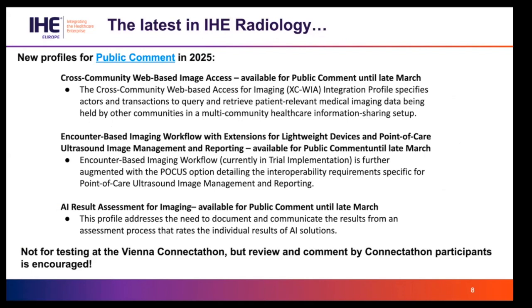And it's based on the initially developed XCAI profile, which has been in trial implementation for quite a while, but eventually was incorporated in the technical framework. But it was based on the outdated web services paradigms.